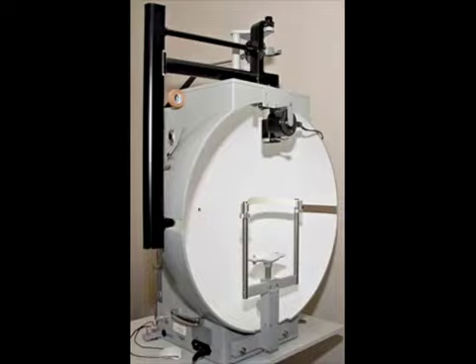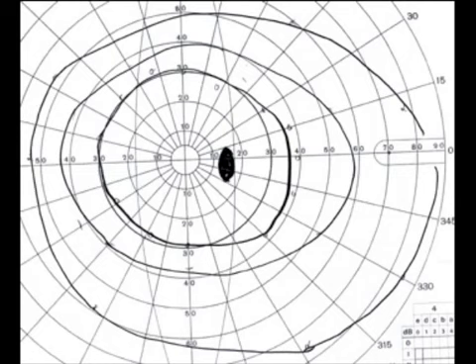each point. In contrast, the Goldmann field is kinetic threshold perimetry, where the light stimulus is moved in towards the centre of the vision until it is detected. The patient again fixes the tested eye upon the central light target, while this time an examiner manually brings lights towards the centre of vision until it is detected. These points are then plotted into isopters, like contours on a map. By repeating with different light brightness or size, the shape of the visual field is plotted.